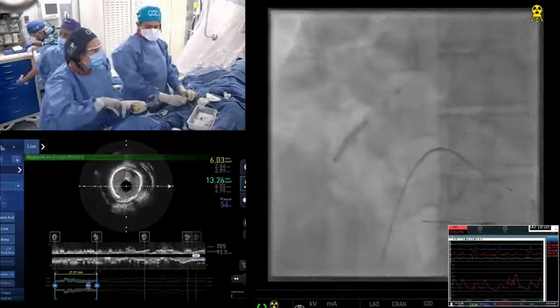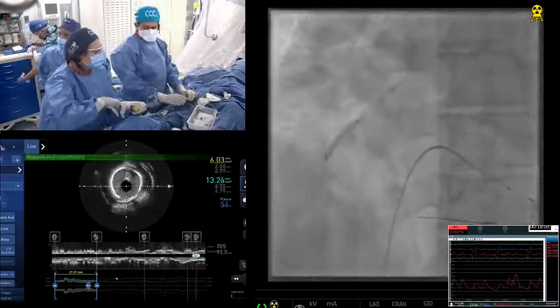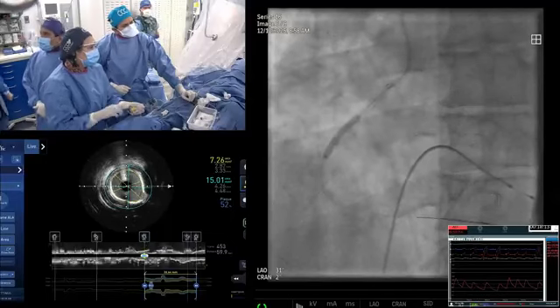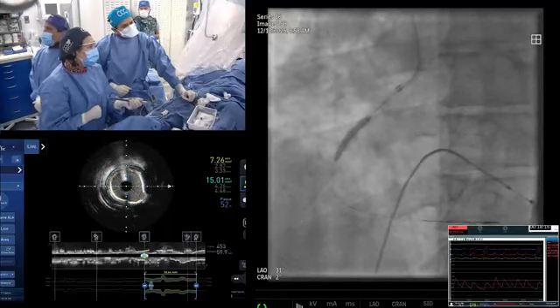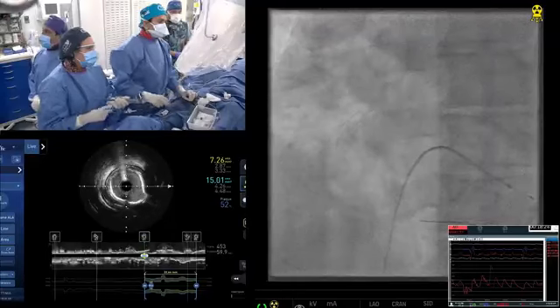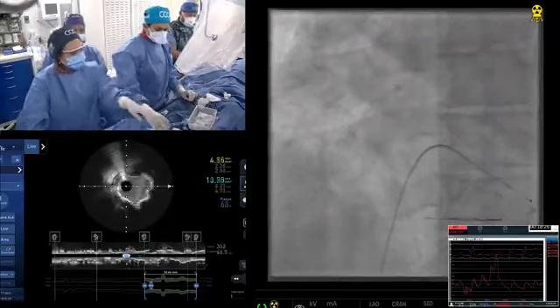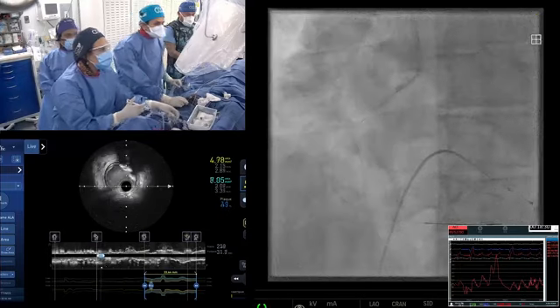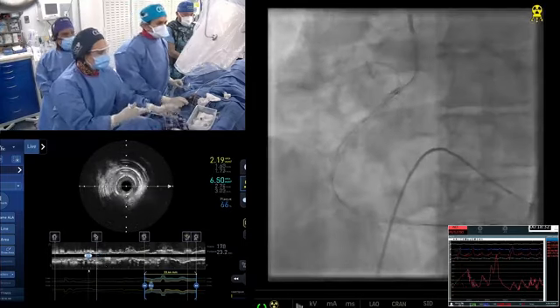So we have not gone to making a low speed of 120 and working that as an orbital atherectomy, because to me it cannot be orbital, because the point is it will deflect back. The orbital works because it's an eccentric crown, and that's the key. So here, if you make a low speed, to me, it will just deflect back from the calcific lesion. That is my hypothesis. I reviewed the paper before it was published, and that was my comment, but I think it was still published. We know that.